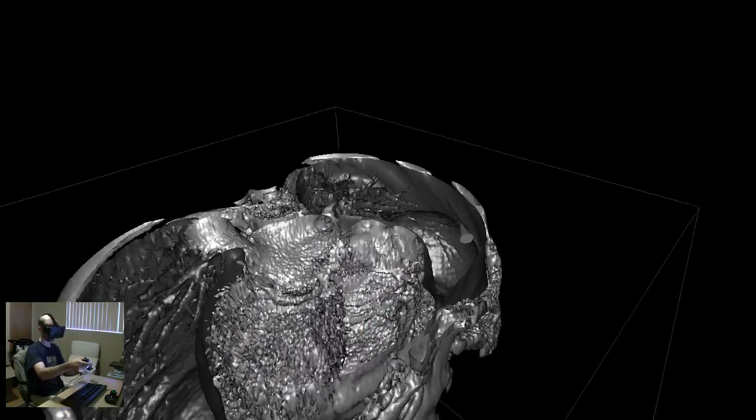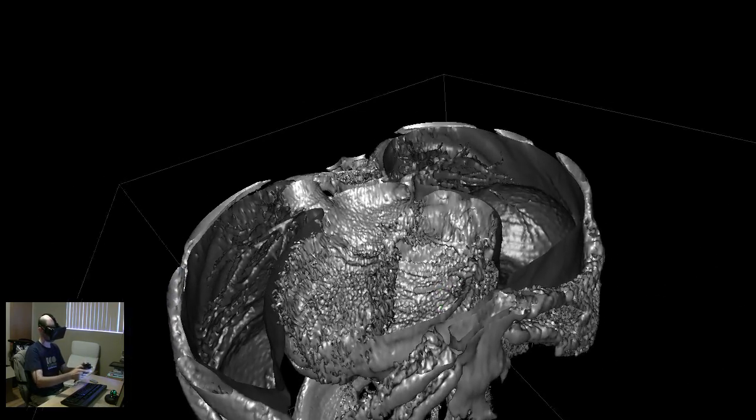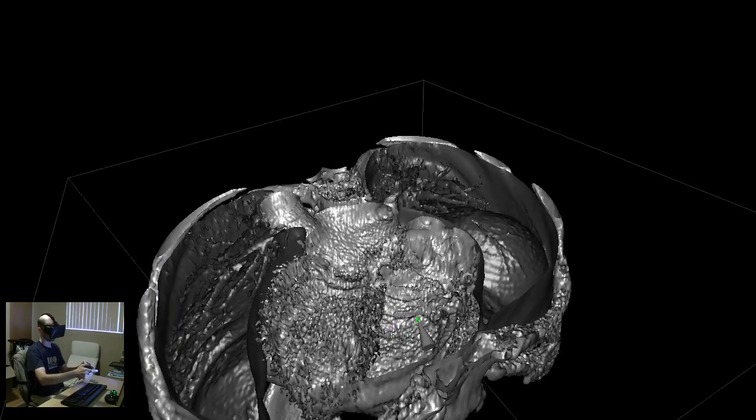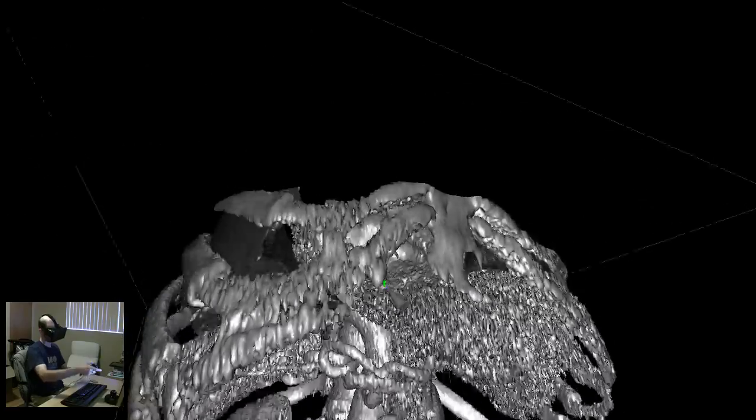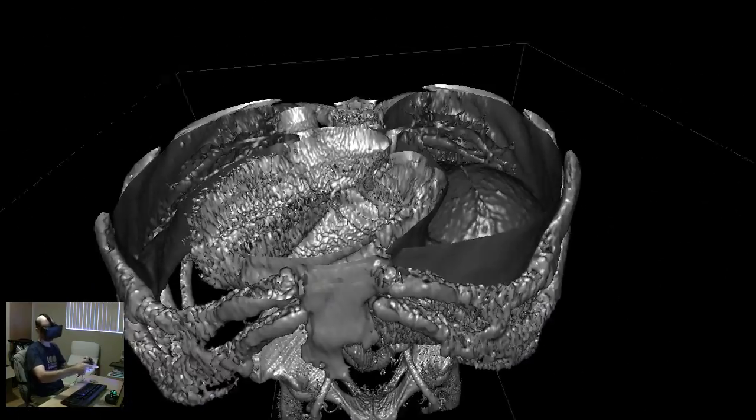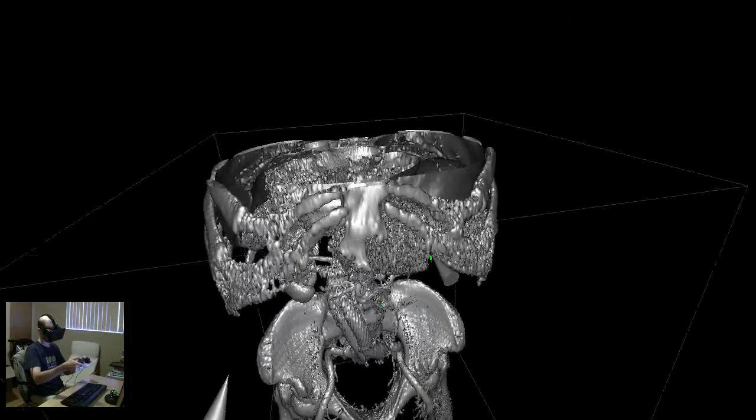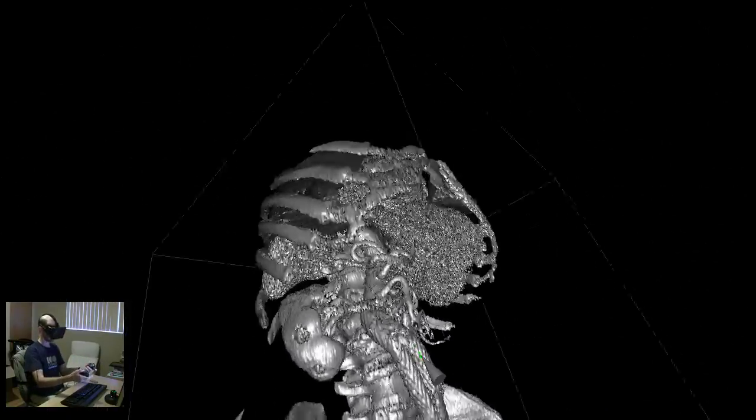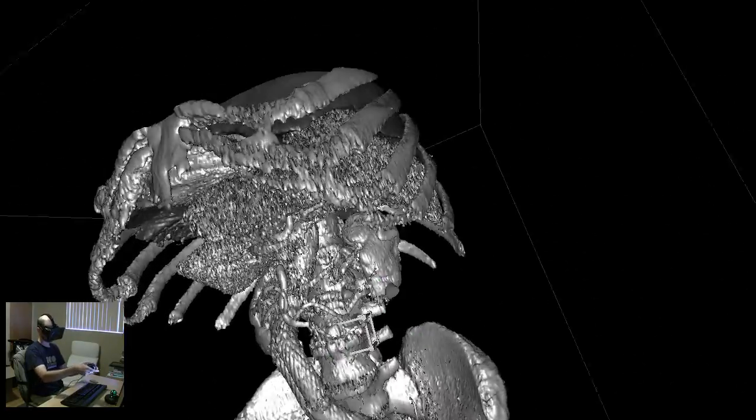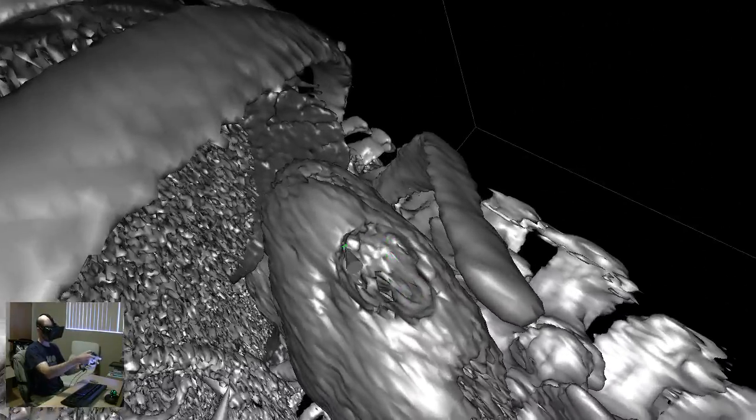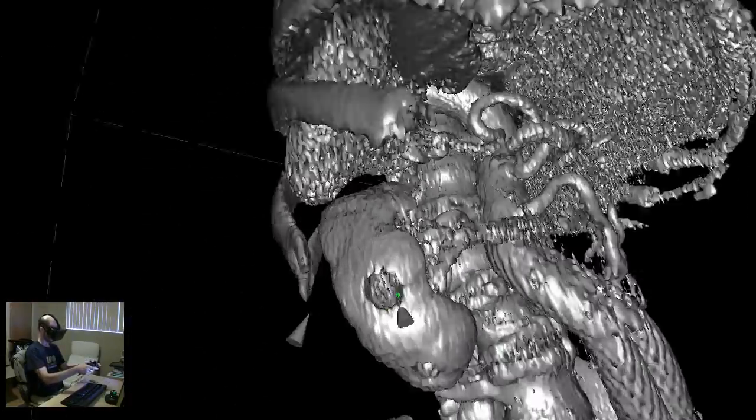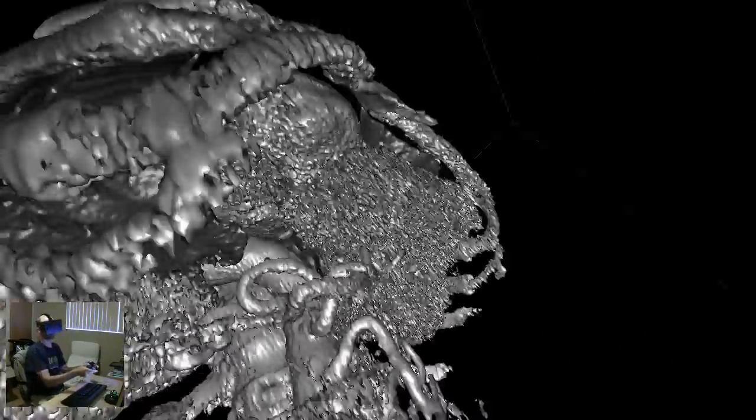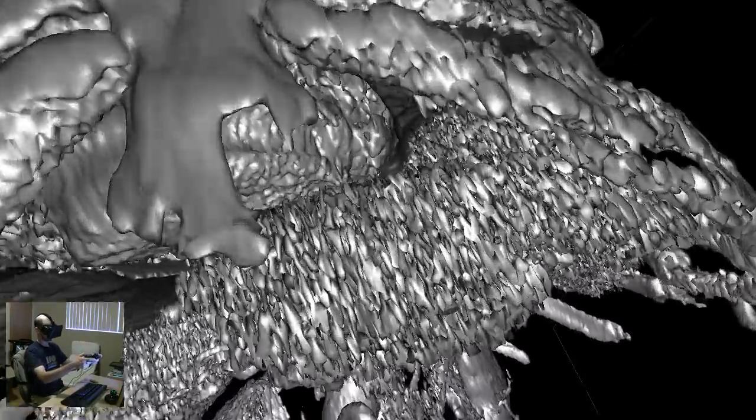Actually, it's part of it. The heart was cut in half by the CAT scan domain. I wish they had scanned just a few inches more, but it doesn't matter. The reason why the heart is so noisy looking is because it was beating at the time the CAT scan was taken. So it didn't really resolve very nicely. And here we also now see a little bit more of the anatomy. Here are the kidneys. And I have no idea why there's a big hole in the kidney here. Or I think there's one over here as well. Again, I'm not that kind of doctor. Somebody will have to tell me.